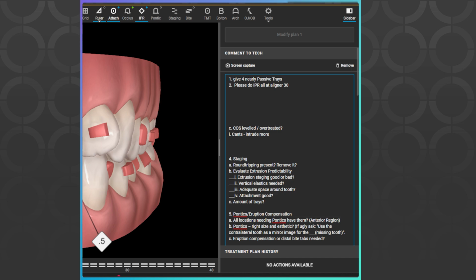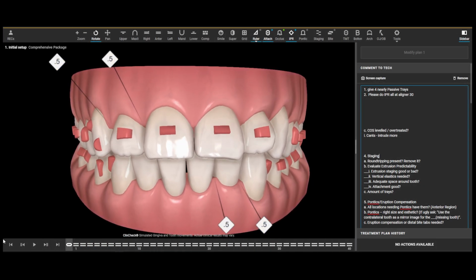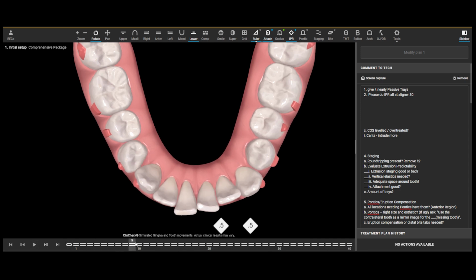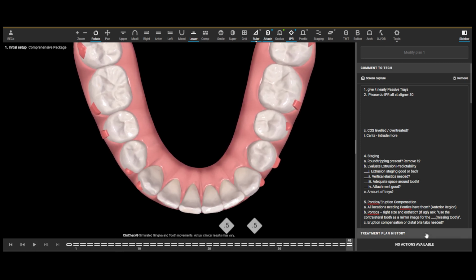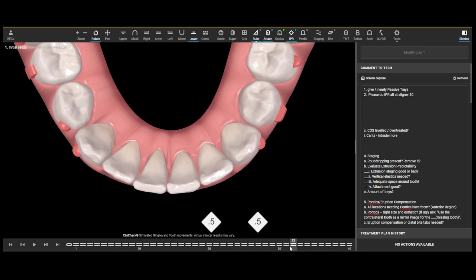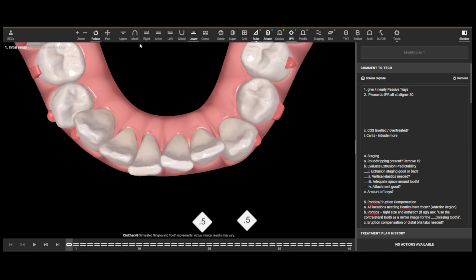So what does round tripping present mean? That means that our teeth are moving one direction, then moving back the other direction for no reason. So is there a purpose for it? Well, you can see here that we said, yes, the teeth all kind of procline and then they straighten the line and then the IPR occurs and they move back into that space that was created. So that is round tripping, where teeth move one direction, right? They go buccally. And after they move buccally, IPR is going to happen and then they're going to close that space. This is round tripping that I'm okay with.